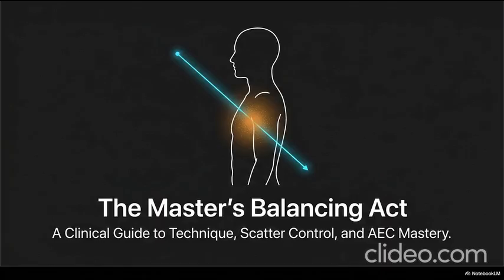The software? Yes. The software analyzes the data, rescales the histogram, and silently fixes the visual contrast. Wait, really? The machine actively masks the error, so the picture looks completely fine on the screen. It looks flawless. It looks like a perfectly executed radiograph. But the physical reality behind that flawless image is that the patient's radiation dose was dangerously high.